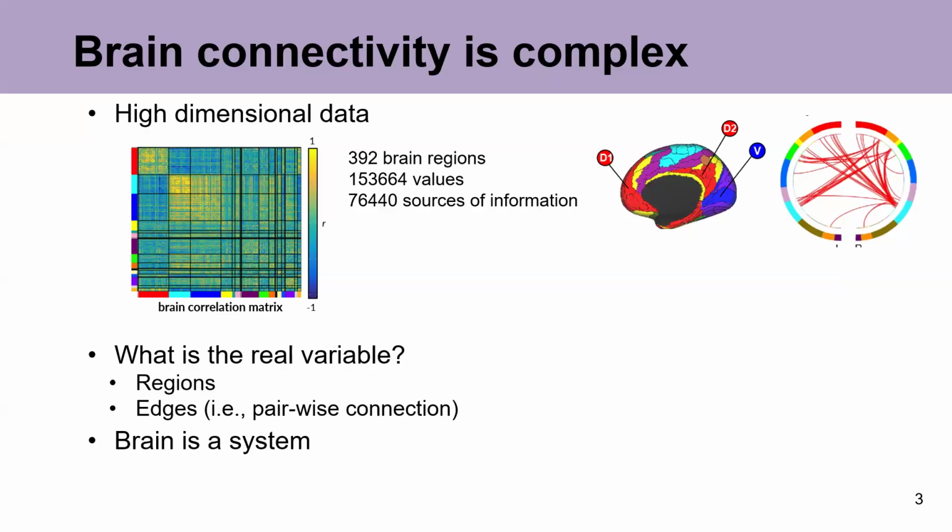So it depends how you define the network. In this case, this particular picture is of networks that were defined based on a clustering algorithm. The network is predefined inside the atlas as a label, because somebody did a clustering algorithm and assigned each region to a network. That makes sense so far?